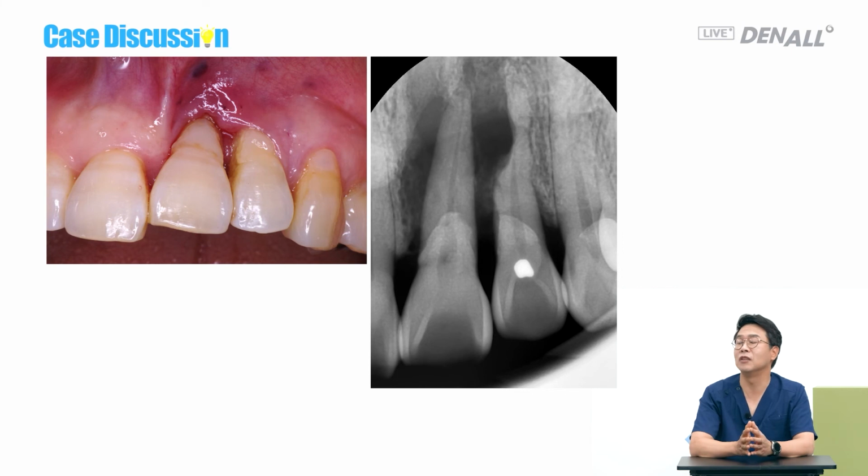That is an issue. As you said, how much soft tissue will be preserved during extraction should be considered. If we can do soft tissue preservation or augmentation, it's good, but we need to prevent the collapse of soft tissue. So there are various collagen products available. If we can prevent the collapse of soft tissue, it will be very helpful. In my case, even for the case under discussion, I would use the collagen materials. As you said before, if infection is active, you should not do it, to reduce the mistakes that we made.